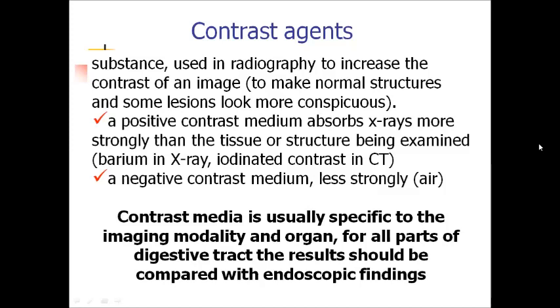Positive absorbs X-ray more strongly than the tissue or structure being examined. It's barium in X-ray or iodinated contrast in computed tomography. And negative contrast medium absorbs X-ray less strongly. Usually it's air as natural contrast. Contrast media is usually specific to the imaging modality and organ. And for all parts of the digestive tract, the results of contrast studying should be compared with endoscopic findings.